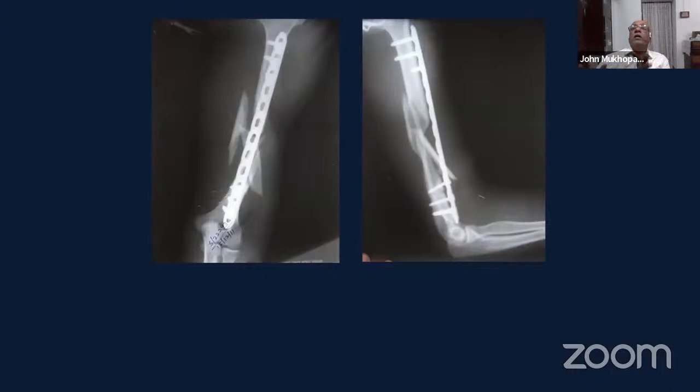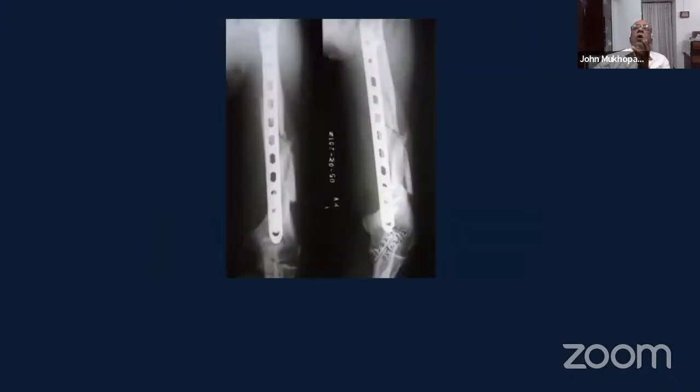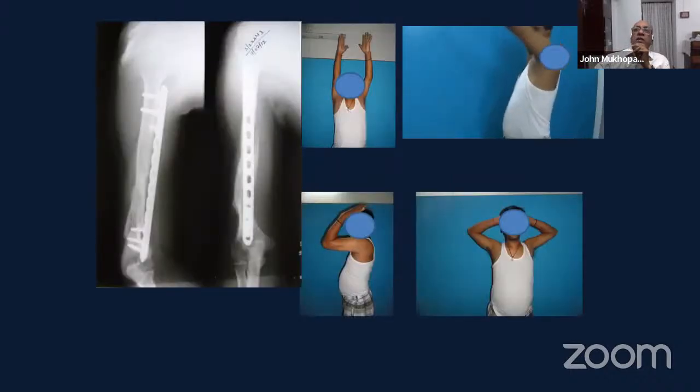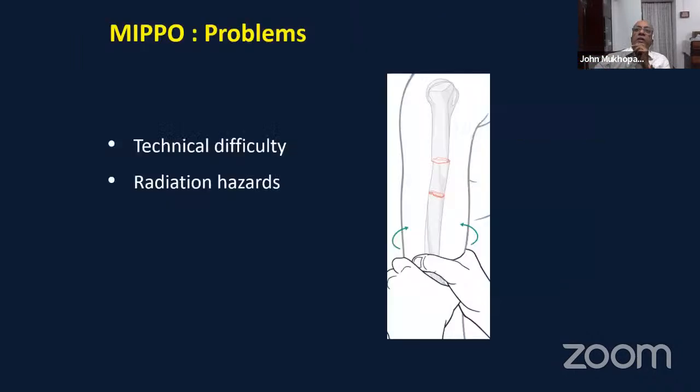And this is what it looks like at the end. If you look at this, you'll be very worried about healing. But because this has been done biologically without disturbing the soft tissue, and then with movement, you can see how gradually the fracture fragments align and heal well with a good function.